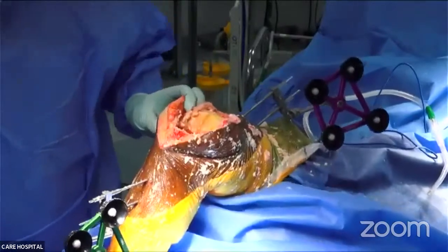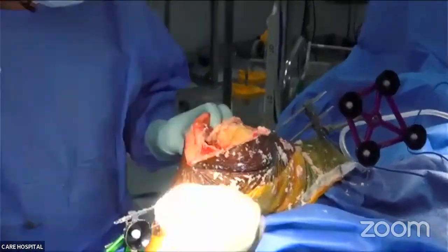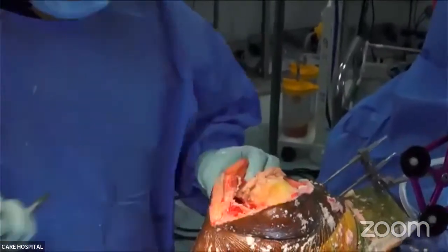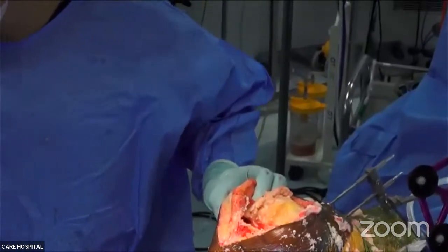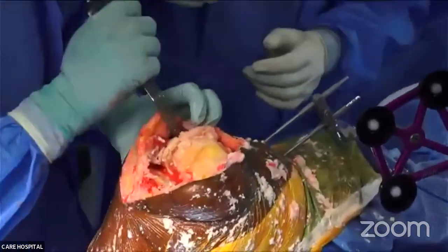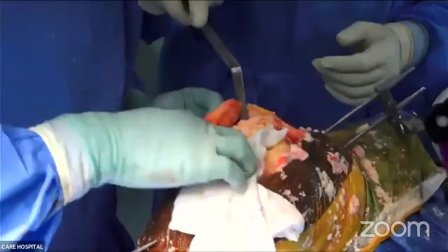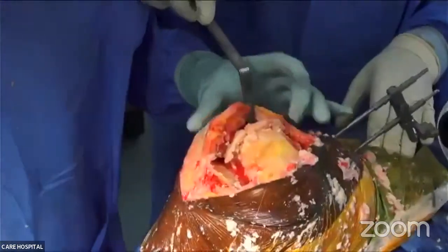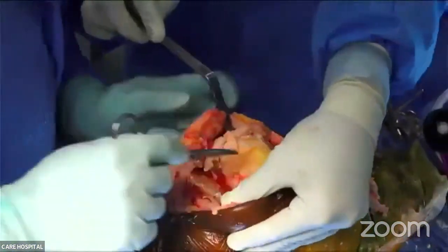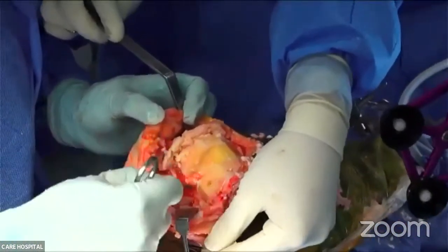Now, as we were mentioning, you can see there is this bone on the lateral aspect, and on the tibia you can see that there is this bone on the posterior aspect.